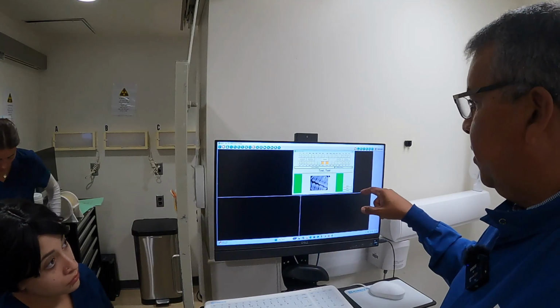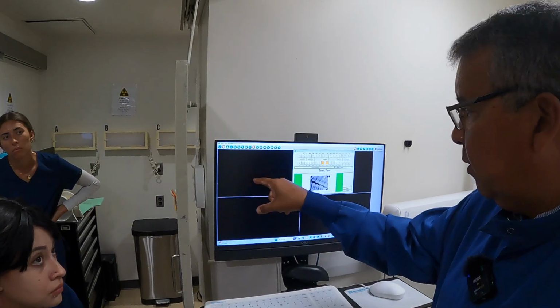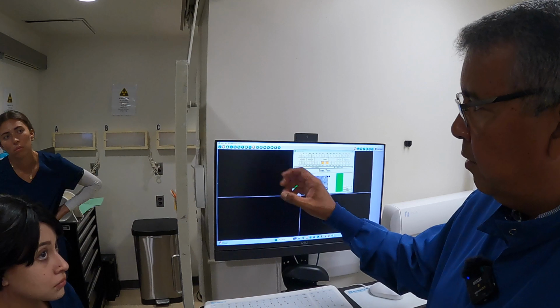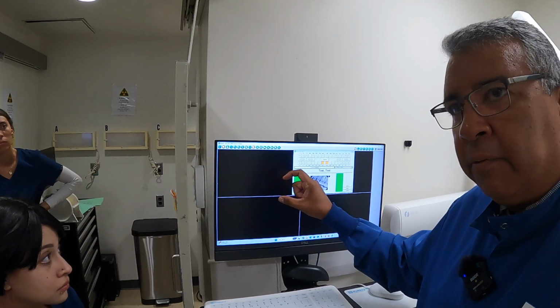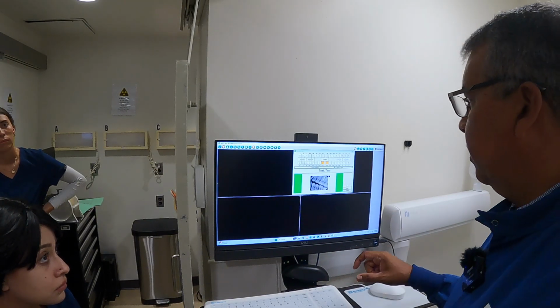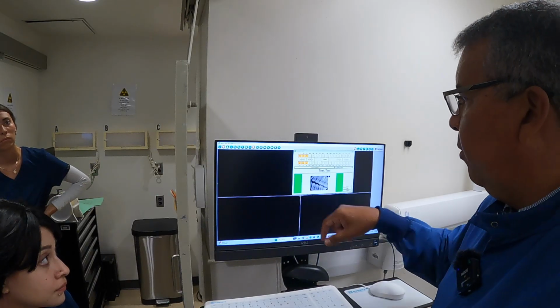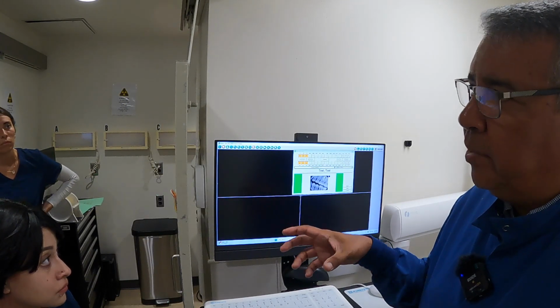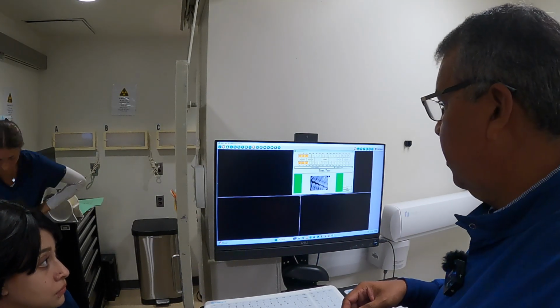Because if you stop at any point, I will know that you stopped it, because right now it's blank, right? There's nothing else on the screen. But if you stop it, your film will then go to the perspective space of what we're trying to do, okay? It'll go to the right side of the screen. It wants to go back here, but we're not doing that. We're going to the molar, okay? Premolar, molar on one side of the patient's face. Be efficient. Stay on that side, complete that side, and then we can move on to the other side.